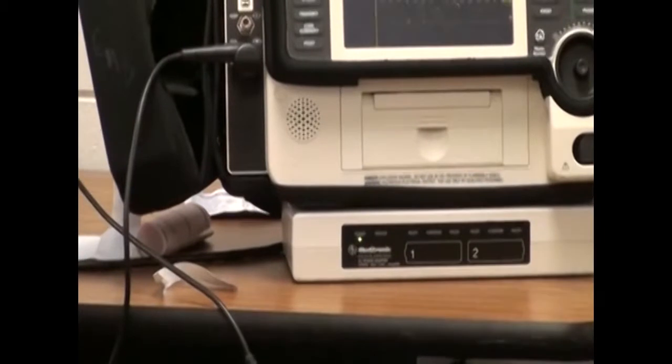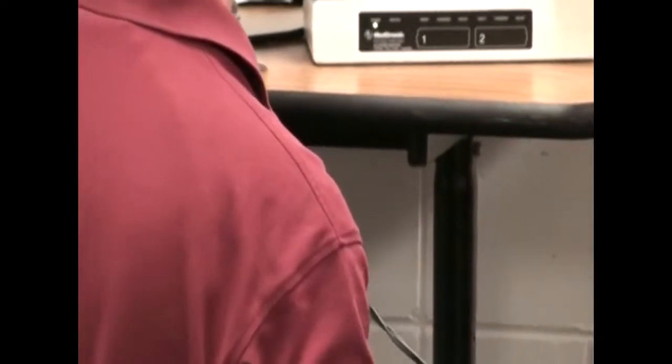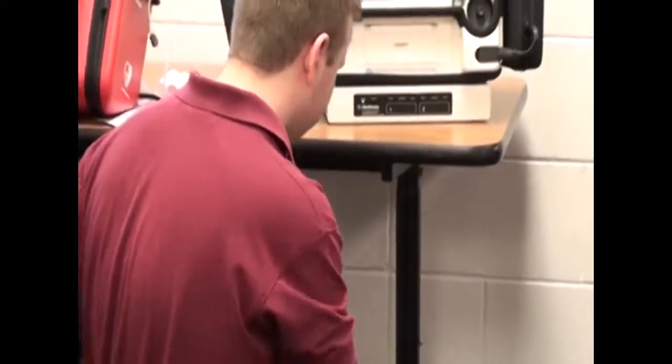Then he's going to look at the cables, make sure that the integrity of them is fine — go from the machine all the way to the patient, just checking that out.